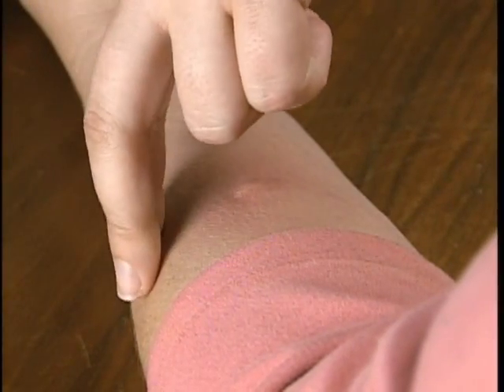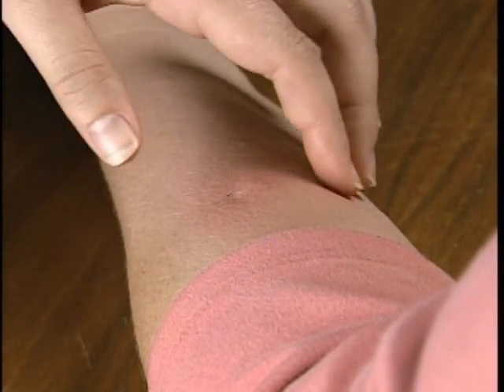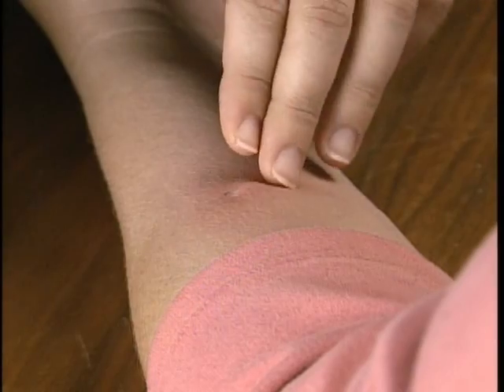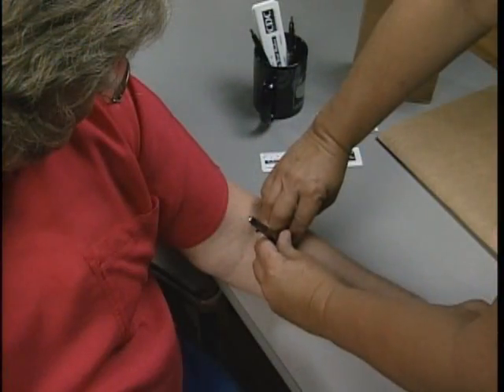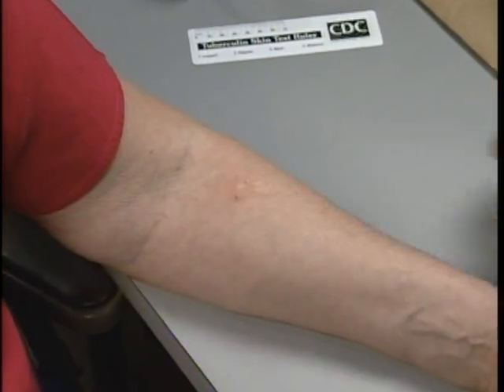If the margin is not equally clear all the way around the induration, it's still necessary to mark the margins on each side of the induration. Palpate around the induration from the easily felt margin to the not so easily felt margin. If the margins of induration are irregular, mark and measure the longest diameter across the forearm.